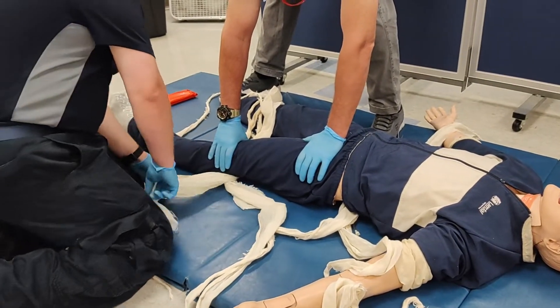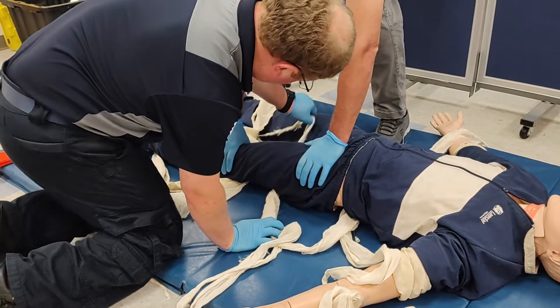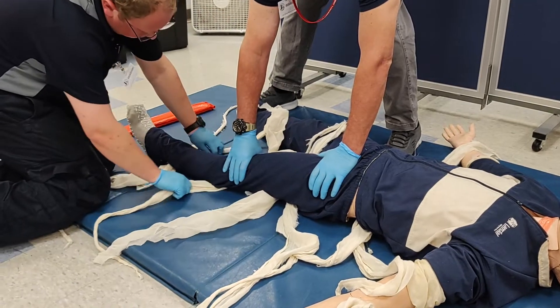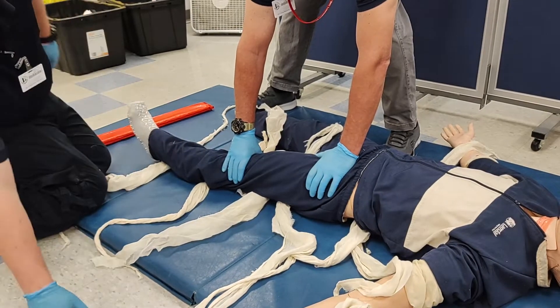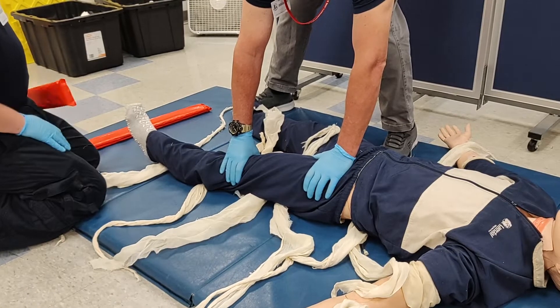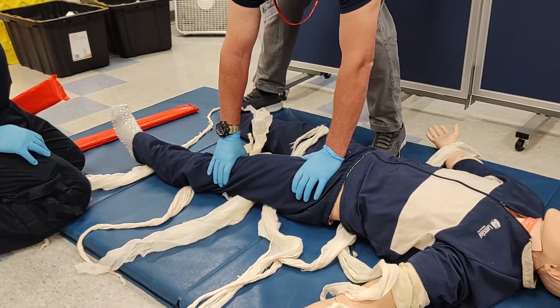Next, spread out the cravats into their locations. One cravat will go underneath the Achilles, one cravat will be under the knee just distal to the knee, one will be above the knee so just proximal to the knee, one will be in the thigh just distal to the hip.